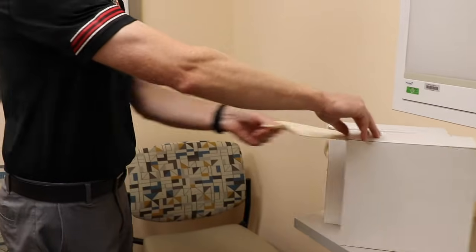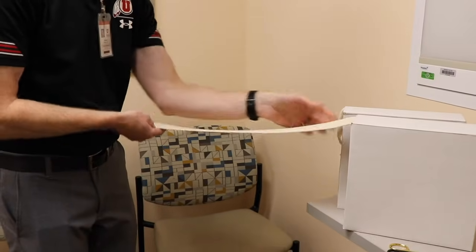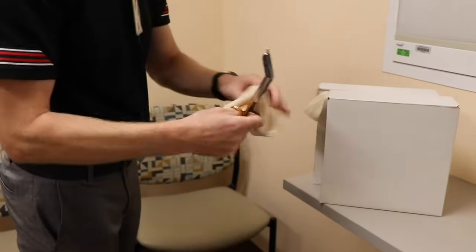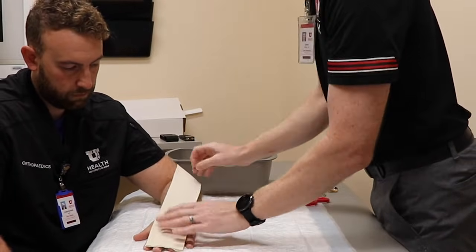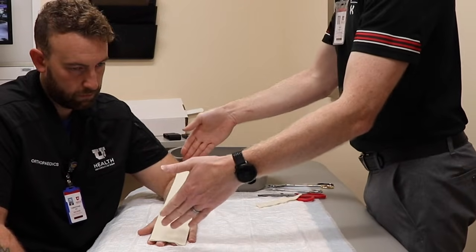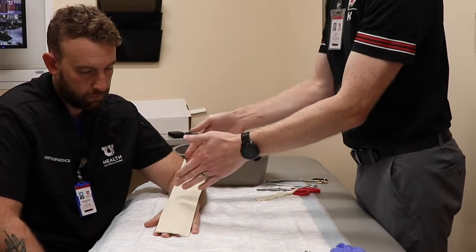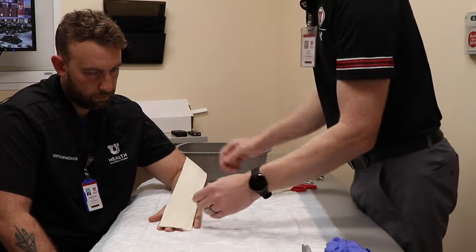So first thing I'm going to do is measure. When I'm measuring the stockinette, I'm typically measuring from my elbow to the tip of my fingers. That way I know it's going to be pretty long. So I'm going about the tip of his fingers, making sure I got enough here. Important thing to know is once you put this on a patient's arm, with the forearm being a little bit wider, it's going to stretch, so just be sure that you are cutting a long enough length.